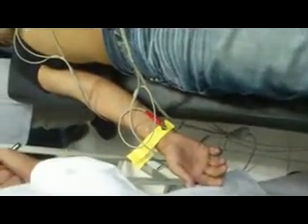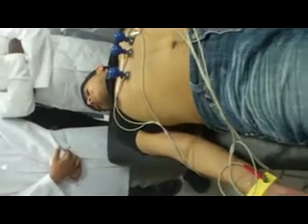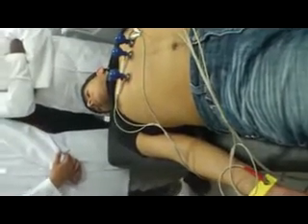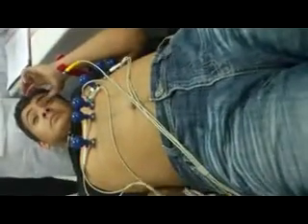Now in this machine, because this is a good automatic machine, there is no need to start or stop. In the other machine there is one button for start and another for stop. Here no, just press one button and it will record all the readings. Process for 10 seconds, process and print it out. No need to stop, it will stop by itself. Understand this? Okay. So everything is attached here? Doctor, yes, I will check.